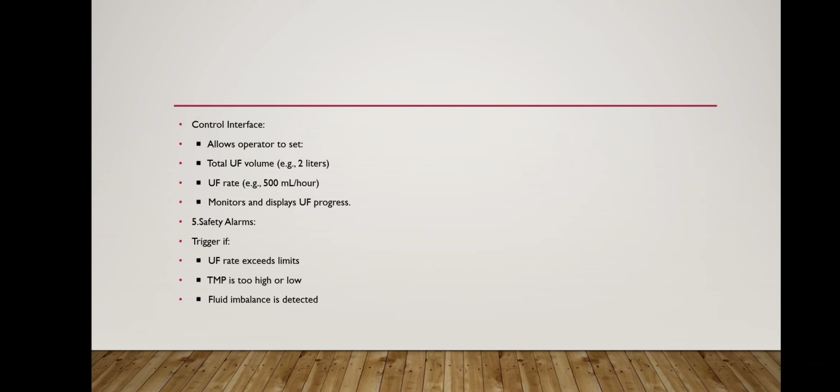The last is the safety alarm, which triggers if the ultrafiltration rate exceeds the limit, TMP is too high or low, or fluid imbalance is detected.